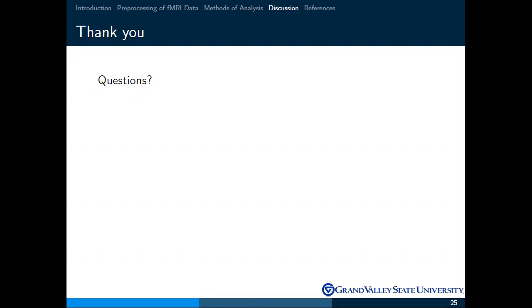Yes, exactly. Yes, that's been done. I would say a lot. I read some papers when getting this together where they showed, for example, if you over smoothed with too much spatial smoothing and you did a functional connectivity analysis, you could find more associations. And similar things with the other steps as well, like motion correction, how overcorrecting can affect the analyses as well. Yeah. It almost feels a little bit like ecological fallacy, right?